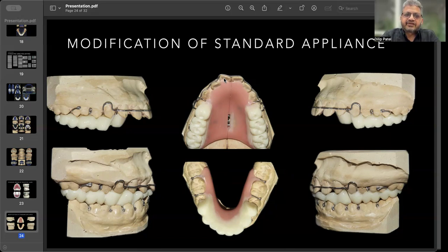Secondly, half C clasps between the canine and premolar and between the first and second molar, and the eyelet clasp is given between the first premolar and the molar. These clasps can be removed as soon as the patient is adapted, or during trimming as and when you require for the eruption of the posterior teeth, and you want to close the posterior bite.